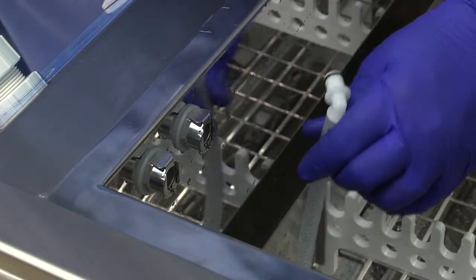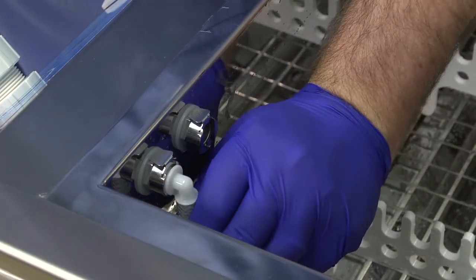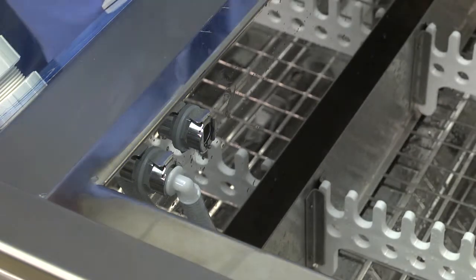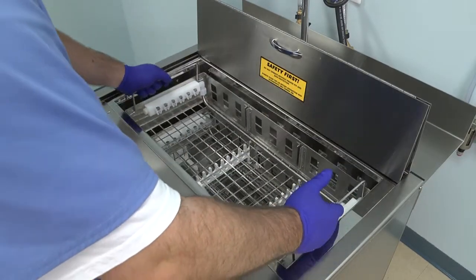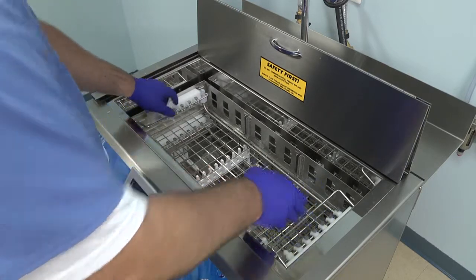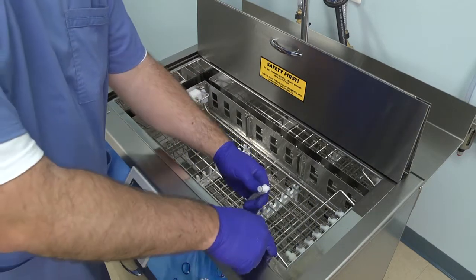Attach the quick connect hose from the basket to port number one on the inside of your machine. Next, insert the top tray again with the port cutout on the right side, then attach the quick connect hose from this tray to port number two inside your machine.